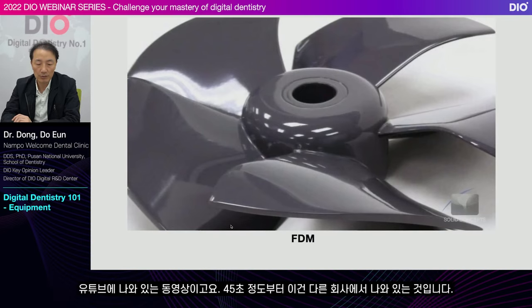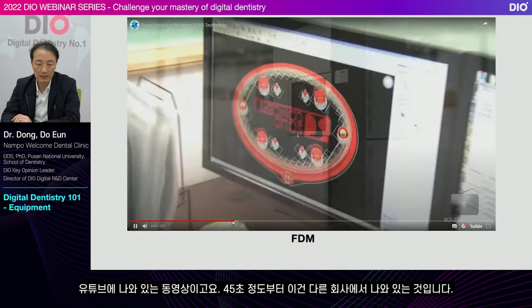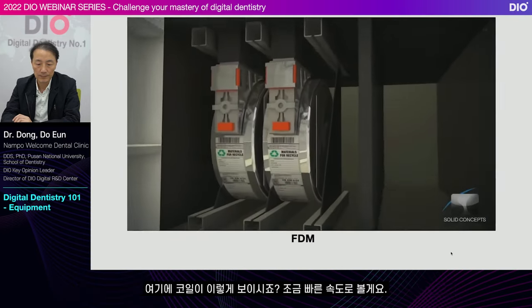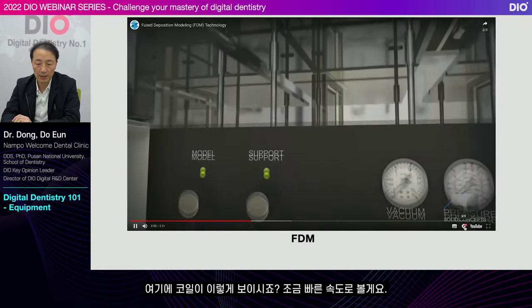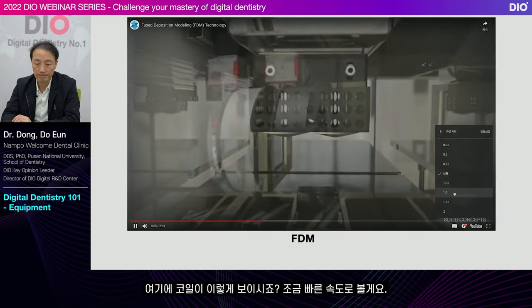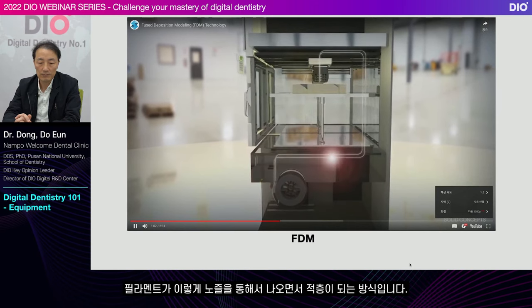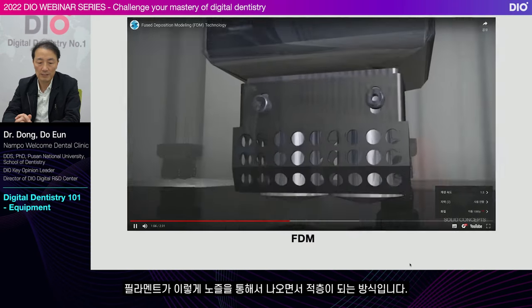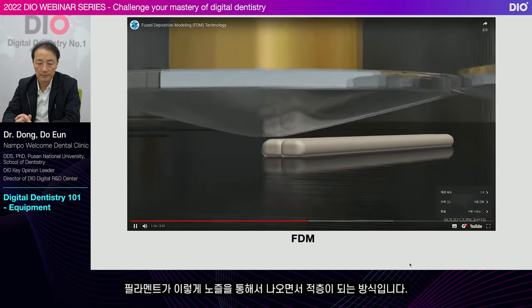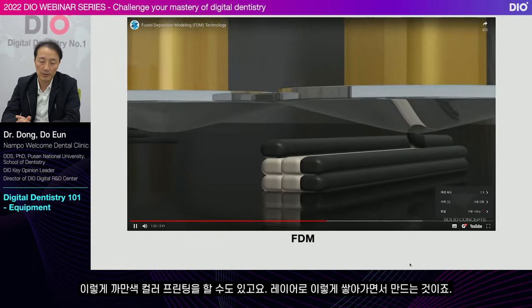This is a YouTube video. From 45 seconds, this is from a different company. Do you see the coil here? Let's speed it up a bit. The filament comes out from the nozzle like this and stacks the layers. So you can do black color printing. You stack up the layers to make it.